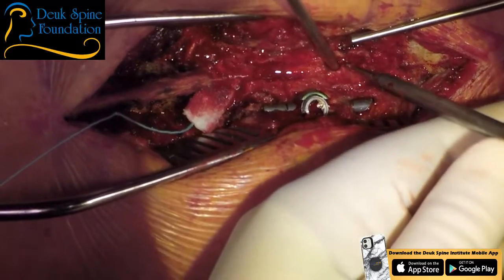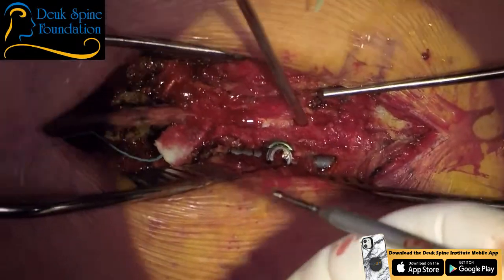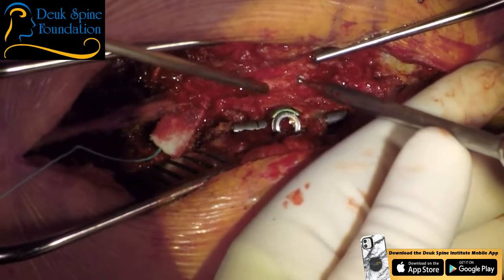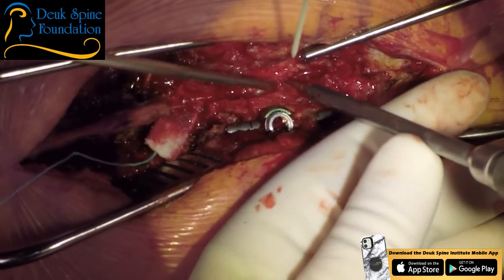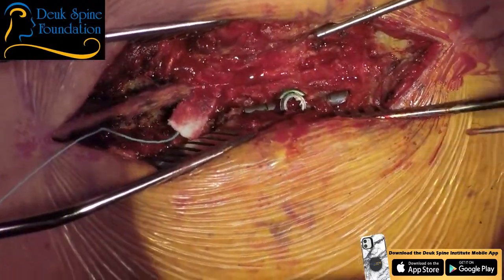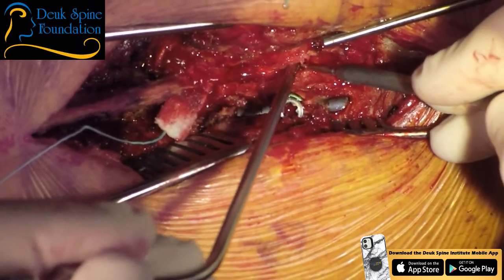All right. So we're making some progress. Right here is my area of concern. That's the last pinched area. If I could just get through here safely and do our laminectomy right here. Sweet Jesus, let me have that. I know you're doing your best, but I've got to be able to see. So it's probably better if I take over for a few minutes.